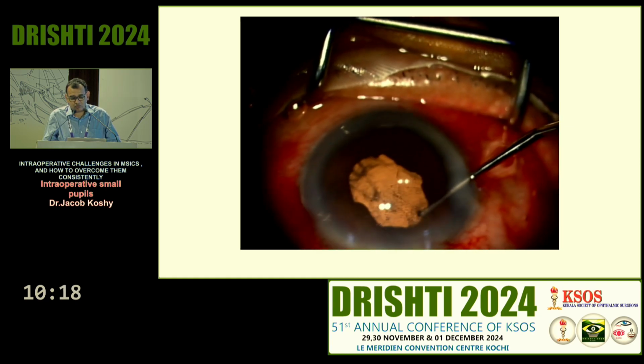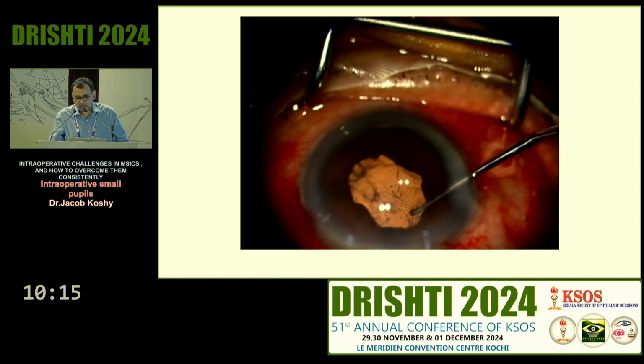Remember to suture these wounds. You have to suture these wounds before you get out.